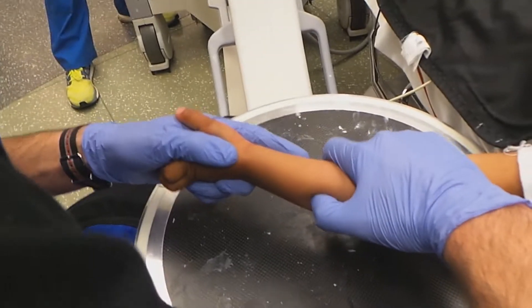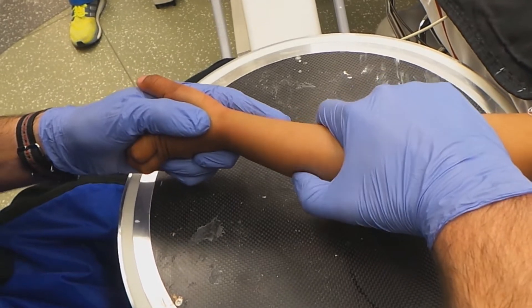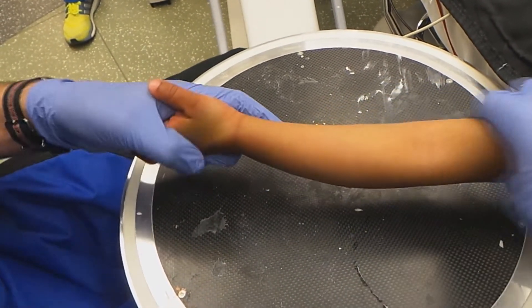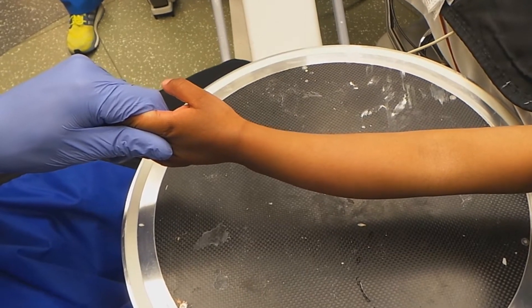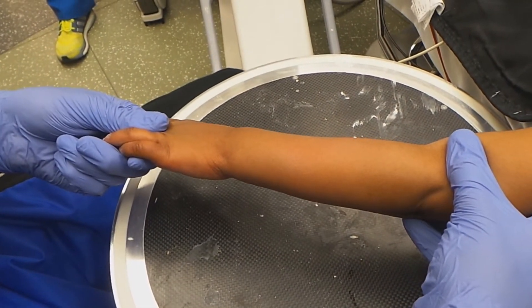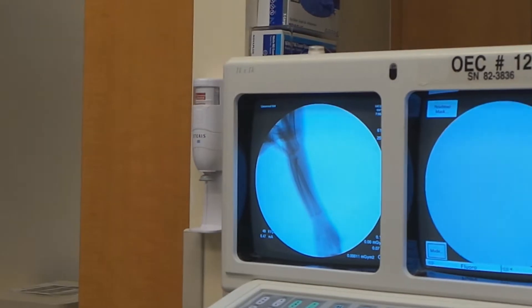So this tiny amount of residual deformity we'll try to make better. So what exactly are you doing? You're putting pressure right over the injury, and then distally you're pushing backwards, right? Right. Thumb right on the injury side, just to give something to lever against. So we've got excellent alignment on the radiograph now. One more picture there.